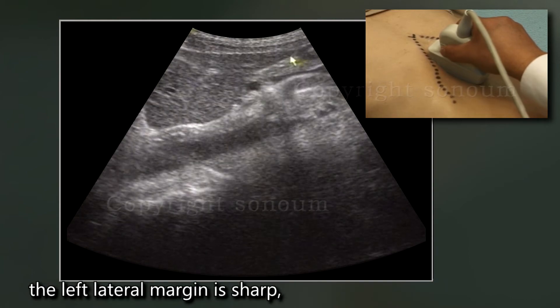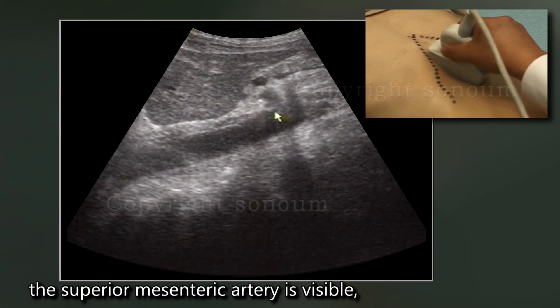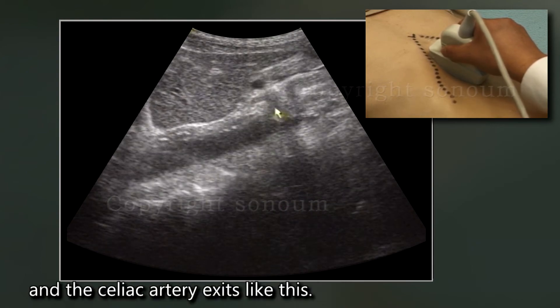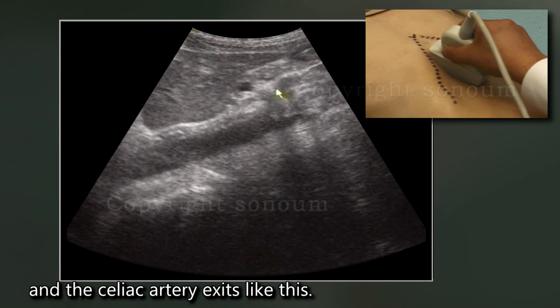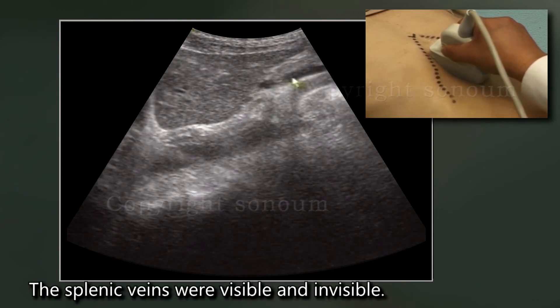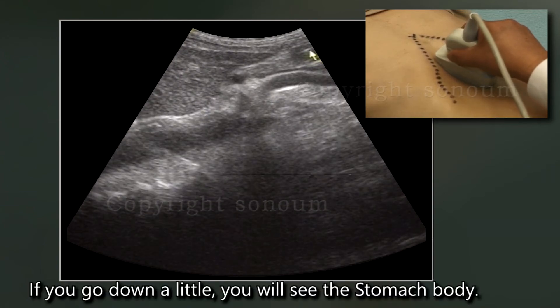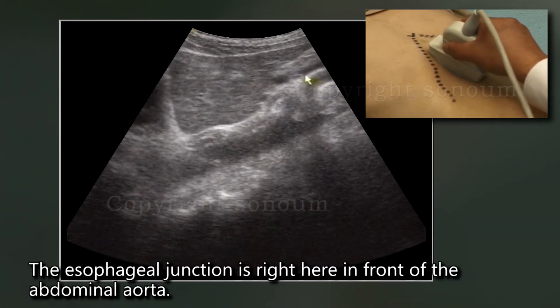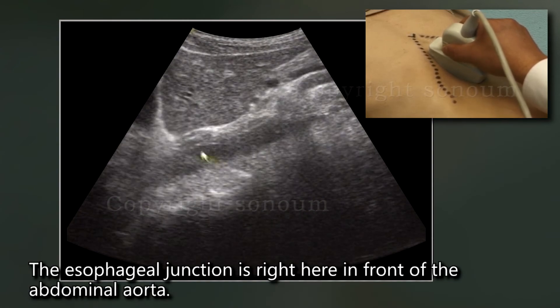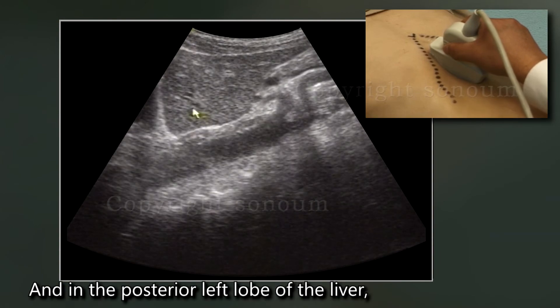The left lateral margin is sharp. The abdominal aorta is visible. The superior mesenteric artery is visible, and the celiac artery exits like this. The pancreas is being observed. The splenic veins were visible and invisible. If you go down a little, you will see the stomach body. The esophageal junction is right here in front of the abdominal aorta, and in the posterior left lobe of the liver.